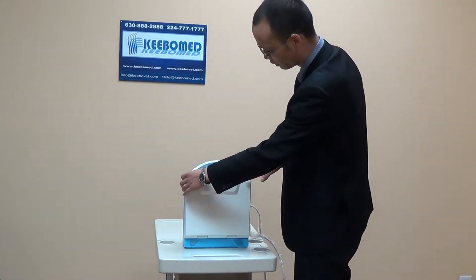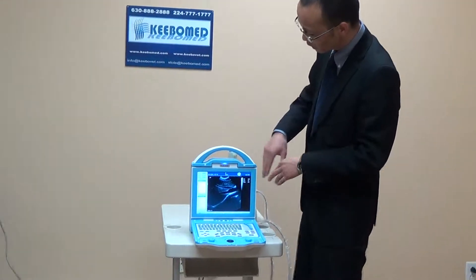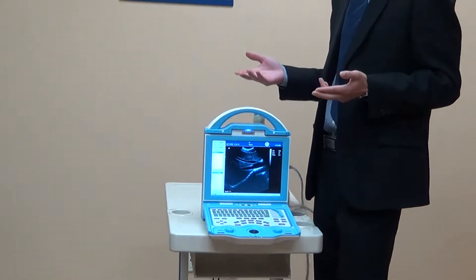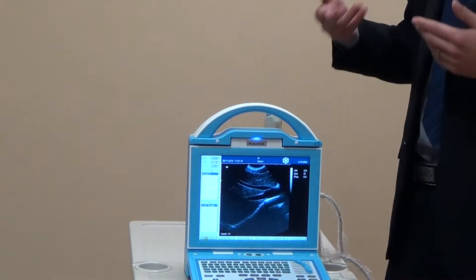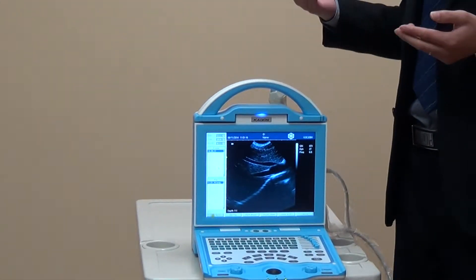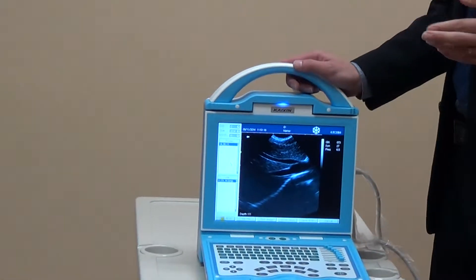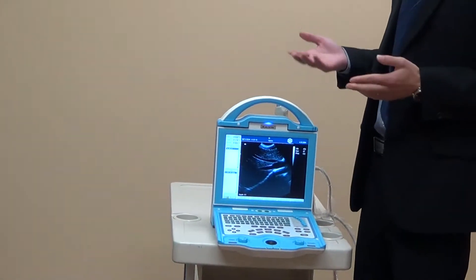For veterinary use, it is very convenient and very necessary to have the battery. Now let's open the unit. As you see, the display is LED, not LCD. LED means you can get a clear image when you work in sunshine. For veterinarians, sometimes you need to work outdoors in sunshine and you cannot see the image very clearly. With the LED display, the image quality and resolution is much better than LCD.